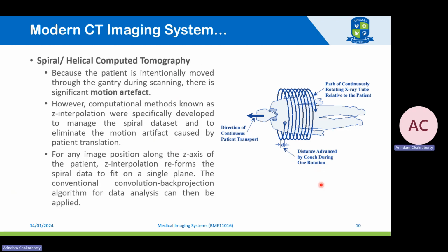Now, regarding the noise that I was talking about, because the patient is intentionally being moved through the gantry while the scanning is in process, it generates a motion artifact. However, there are computational methods known as Z plane interpolation, or simply Z interpolation, which were specifically developed to minimize this motion artifact by managing the spiral data set and eliminating this motion artifact.